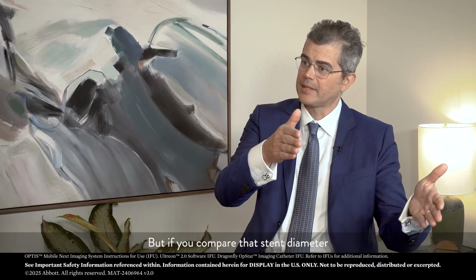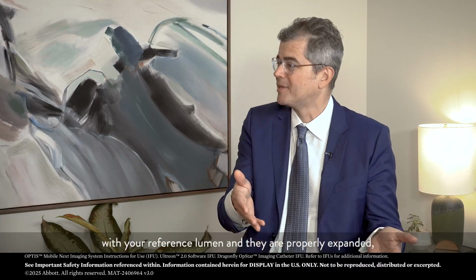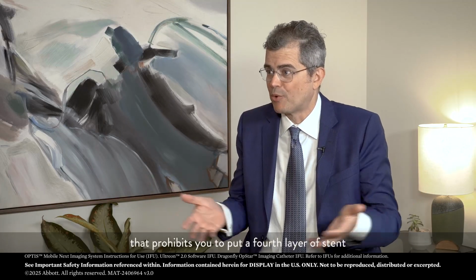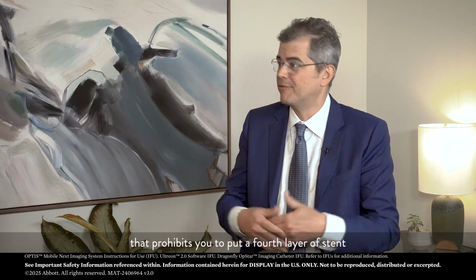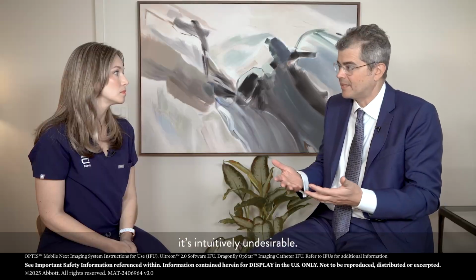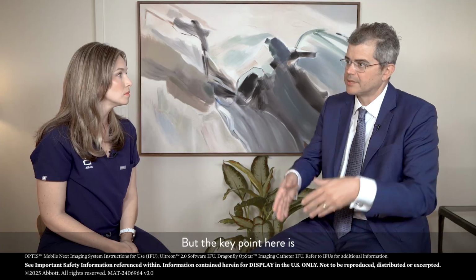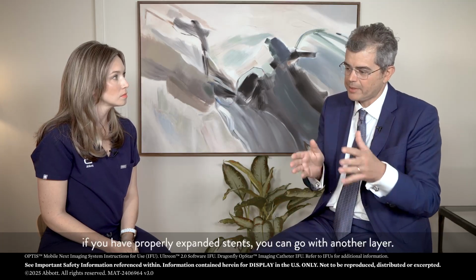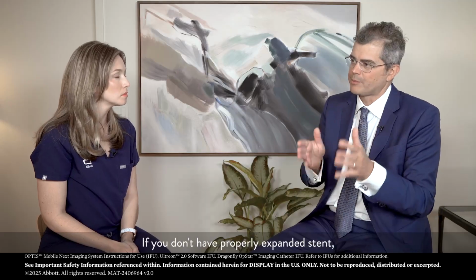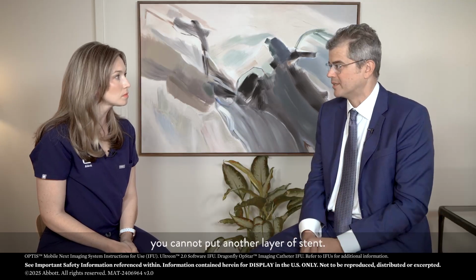But if you compare that stent diameter with your reference lumen and they are properly expanded, there is biologically nothing that prohibits you from putting a 4th layer of stent. It's intuitively undesirable, but the key point here is, if you have properly expanded stents, you can go with another layer. If you don't have properly expanded stent, you cannot put another layer of stent.